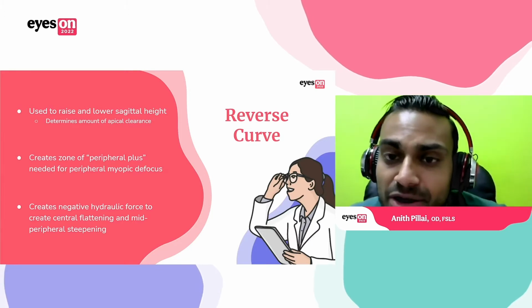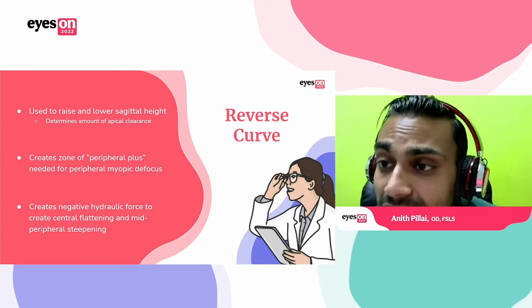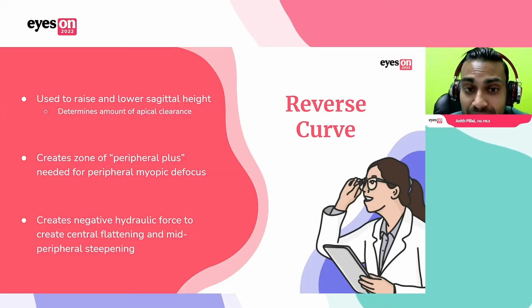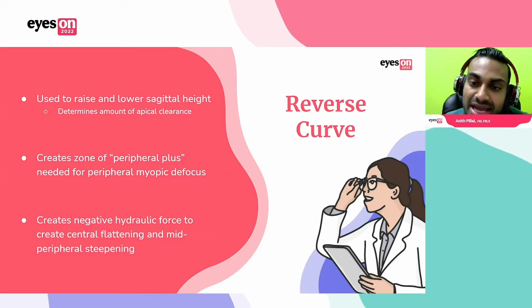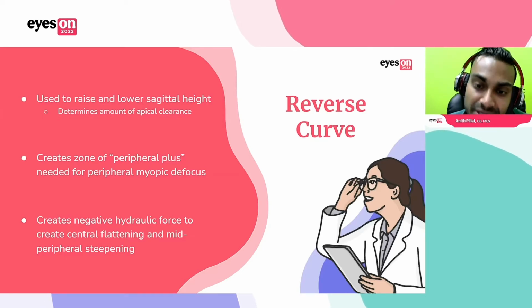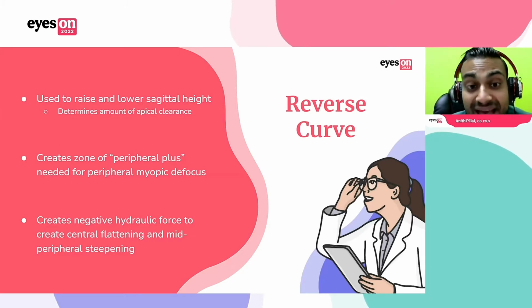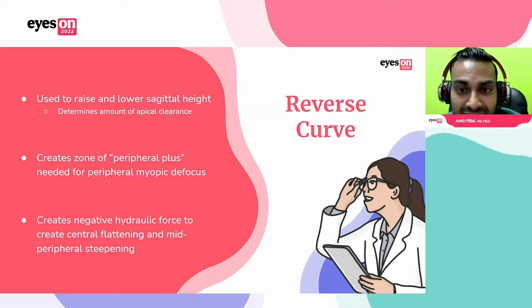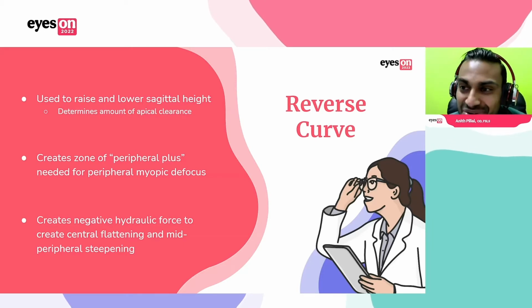For those that follow myopia control, you know what we're trying to do is create a peripheral myopic defocus. That term comes up a lot. And that peripheral myopic defocus, that retinal image shell, is created by that reverse curve. That mid-peripheral steepening is what causes those light rays to now focus anterior to the retina instead of posterior to it. That's what creates that peripheral myopic defocus. And that's what we need for a good myopia control effect. So everything we're doing with Ortho-K to limit progression is happening by this reverse curve. That's why I say this is where the magic happens.